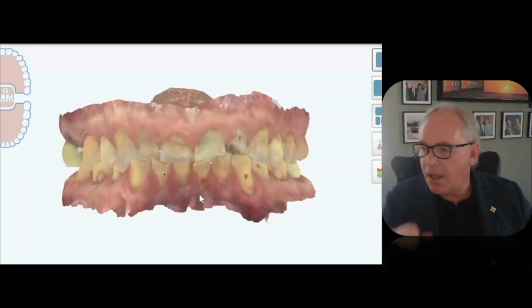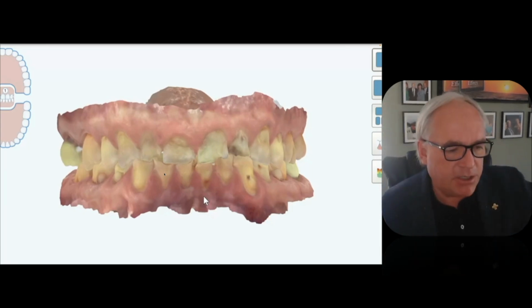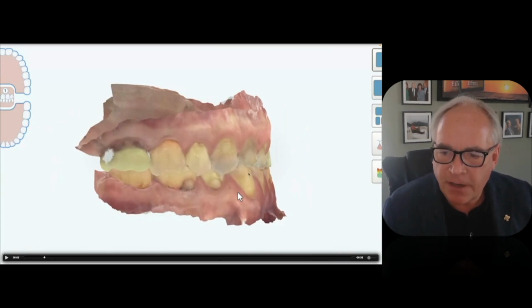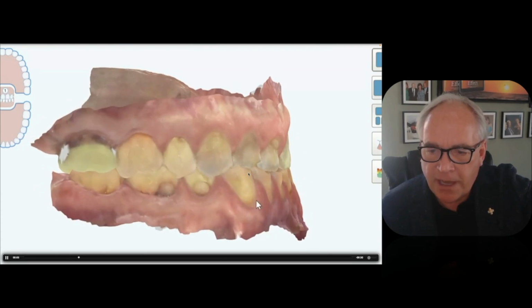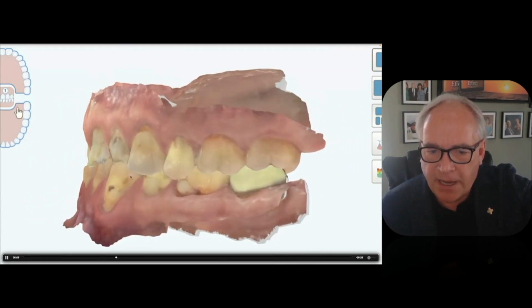All right, let's look at the video of the scan. And what I want you to pay attention to is look where the canine is in his MI. And it's very class 3, very over-closed looking. And I want you to look at him when we open the vertical about 2.5 millimeters with our leaf gauge in centric relation. So look at the canine.